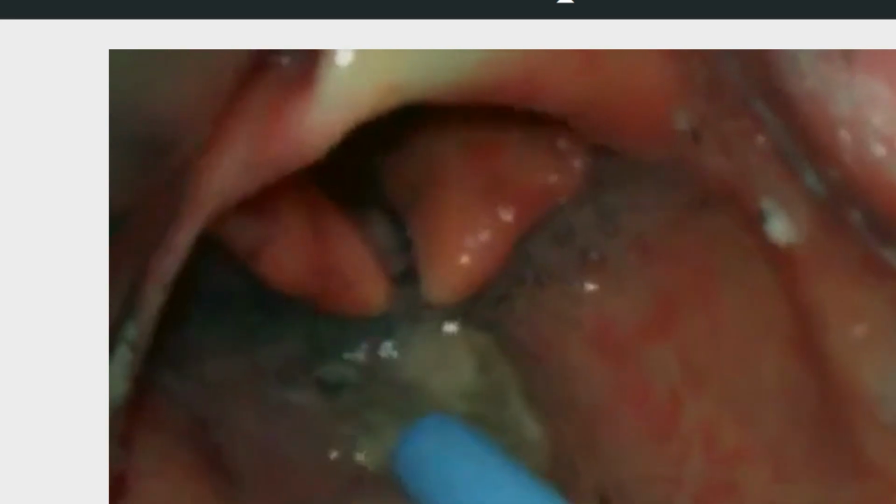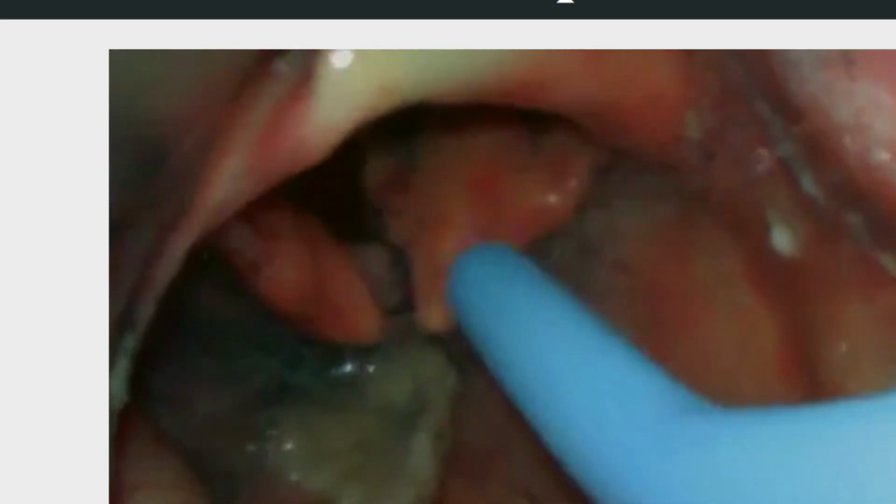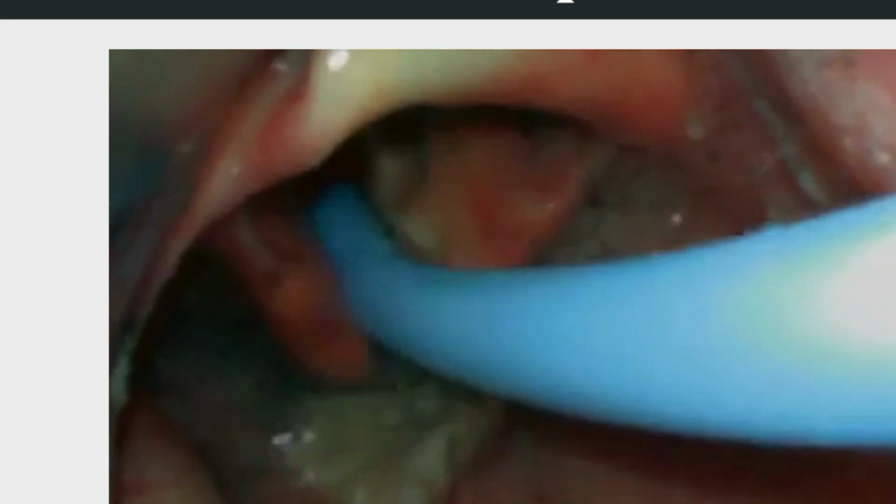It is beautifully shown in this particular video, so you can check it out. This is actually taken from YouTube. It is not my video. And see, you can send the bougie like that, and on top of that they would be threading the tube.